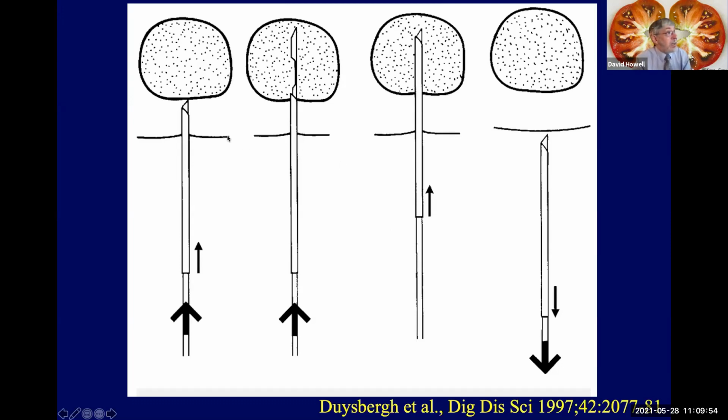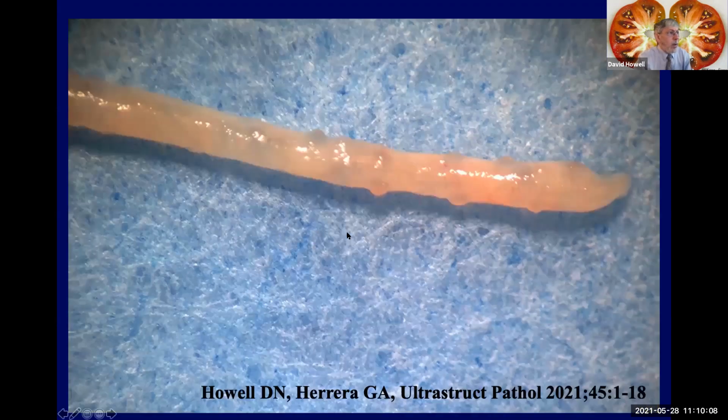So in this case, since the tip went into the corticomedullary junction, the sample that's procured is entirely medulla, which might be useful for diagnosing certain diseases, but is absolutely not useful for diagnosing glomerular diseases. Now, here's an image of what a core of renal tissue that actually contains glomeruli and cortex looks like.